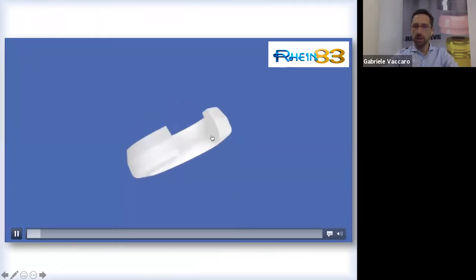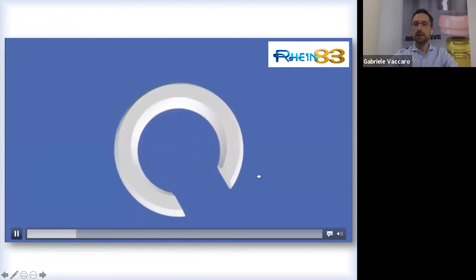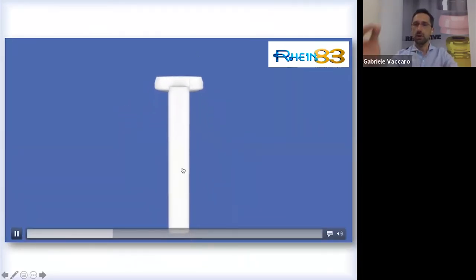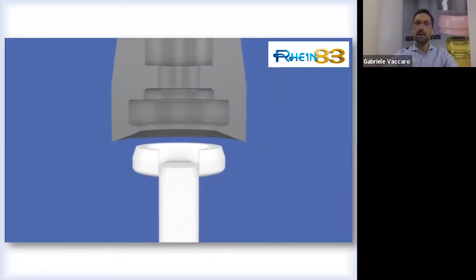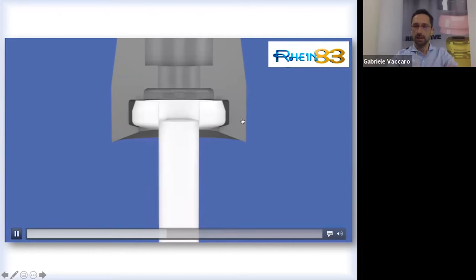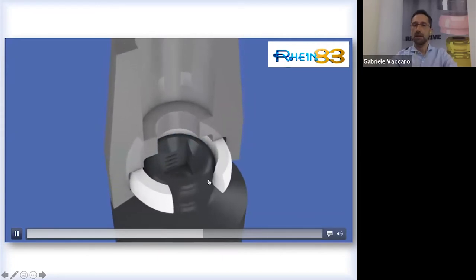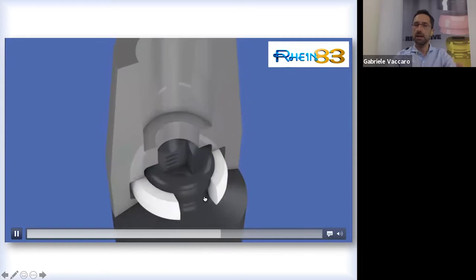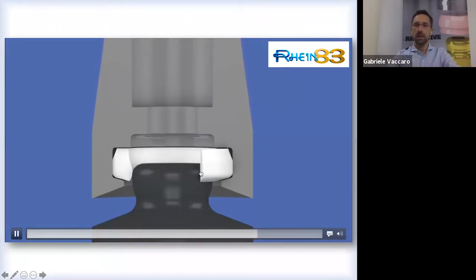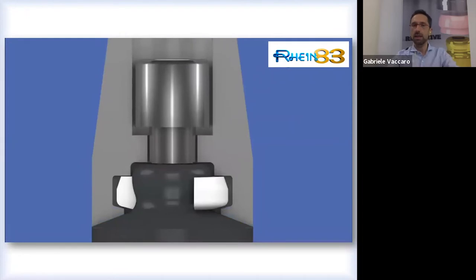It's an incomplete ring, so it's open on one side. It has a fatter part at the bottom, and this part goes exactly under the equator of the attachment. It has a handle with which you can hold it and put it in its place. It must be placed by the dentist exactly in its housing, in the metal housing that goes in the framework of the denture that we are building up. And then it opens up over the equator and then clips when the equator has passed. This is how it works in a frontal view. So the spring is opened, and now our fixed prosthesis is first of all snapped on, clipped on our implants.